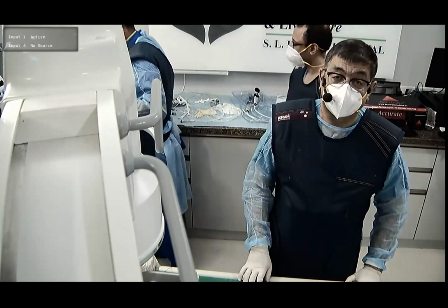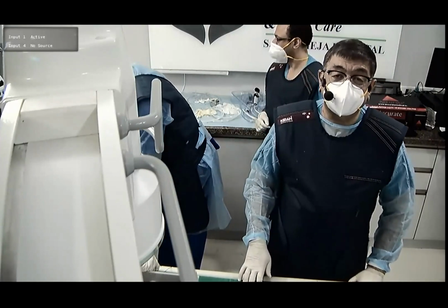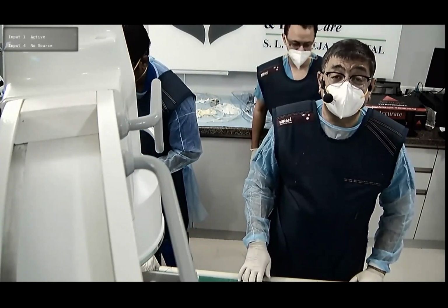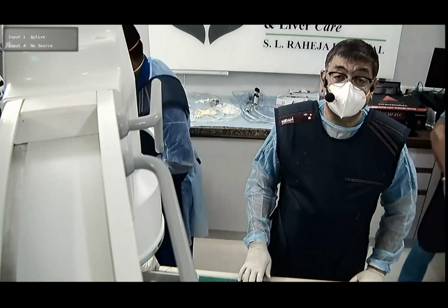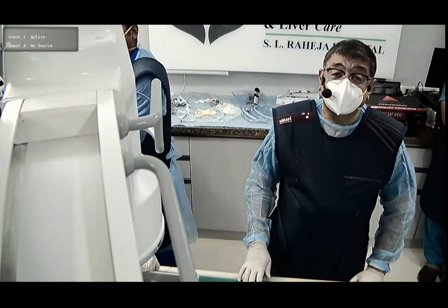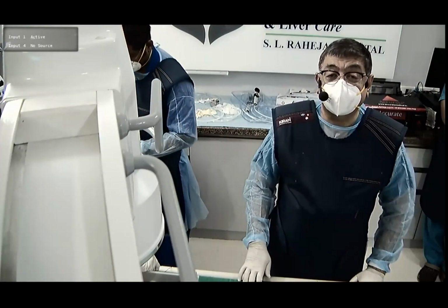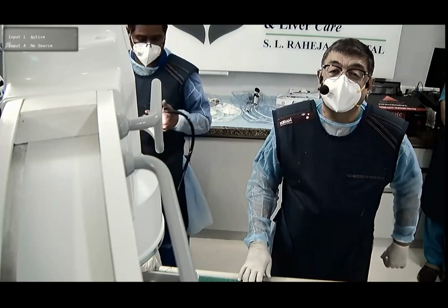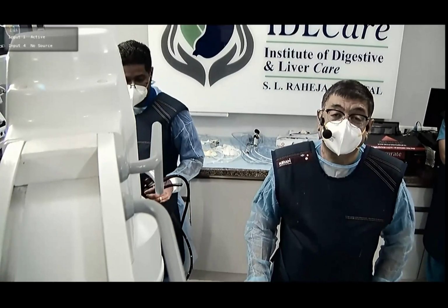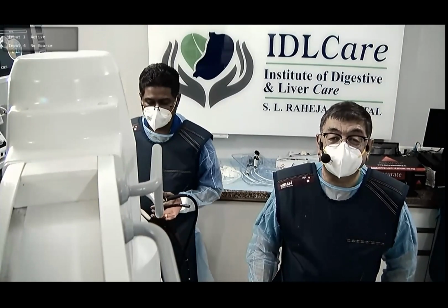It's like ERCP. When we started learning ERCPs, we were trying for 2 hours and all those patients would have pancreatitis. Now we have guidelines not to try more than 5 minutes. And I think that makes sense because frankly, you know in the first 10 minutes whether you are going to succeed or not, and trial beyond that only creates more problems. So I will say 30 minutes is the upper limit. Probably at 15 minutes you can say, no, this is not happening. Forget it.